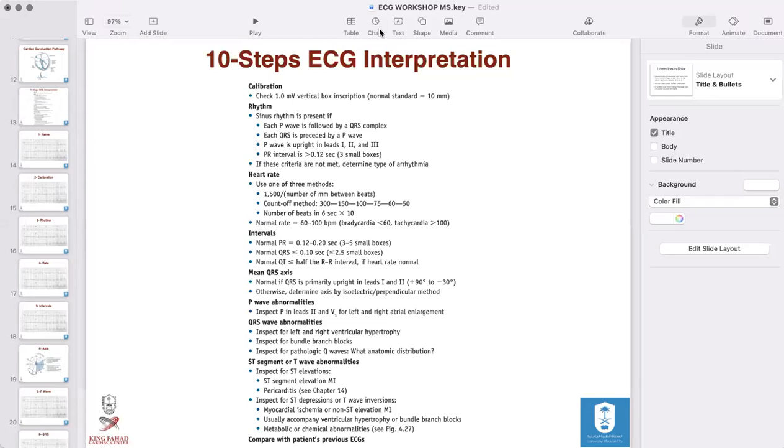Because about 1 in 10 will have isolated posterior infarction that you do not see on the surface. That's where we put V7, V8, V9, those are posterior leads, and the right-sided leads for RV infarction. That's where you need to rule out isolated posterior infarction, or you want to rule in right ventricular infarction. And that's the value of those extra leads. This is the only reason they usually do it in the emergency department.